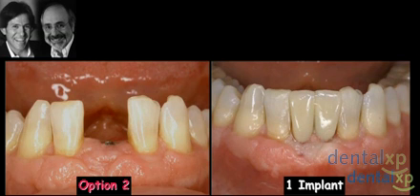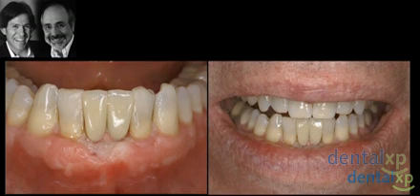Well, we see two different options here that David and I want to focus on, not just in the maxillary anterior region, but the mandibular anterior region, which is to deal with it by segregating the implants on the first case, placing them in the lateral position, or to do it with a single implant supporting two teeth and utilizing artificial gingiva at the midline, which is another option. And here's the final aesthetics.